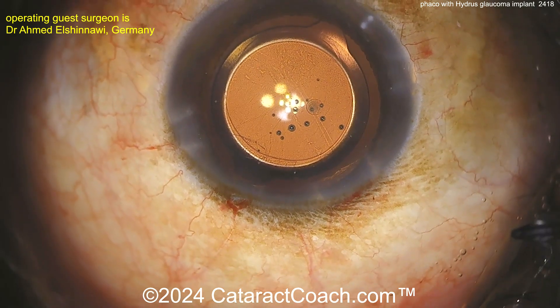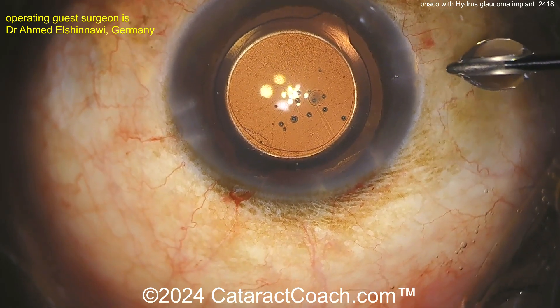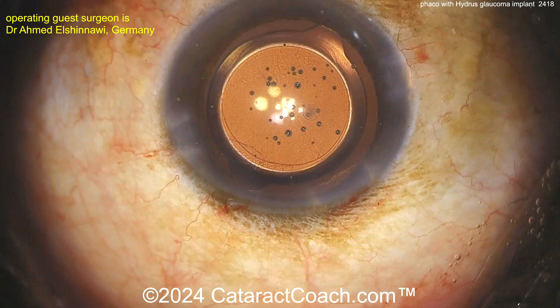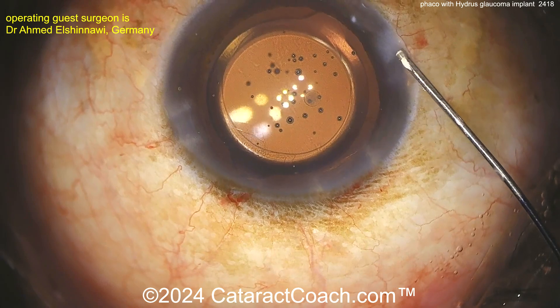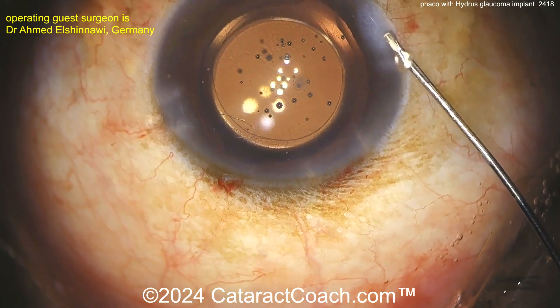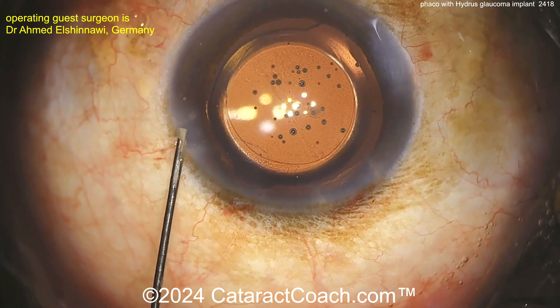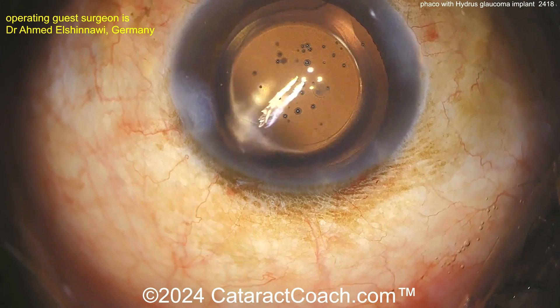Here at the end of the case, beautifully done. I like that the rhexis is overlapping the optic 360 — beautifully positioned. I also like the choice of a monofocal IOL, which is a great option for patients with glaucoma disease. For my preferences, if you have significant glaucoma, you should really just get a monofocal lens.